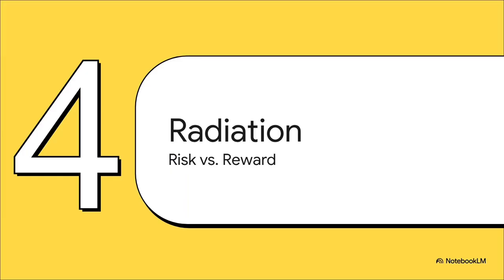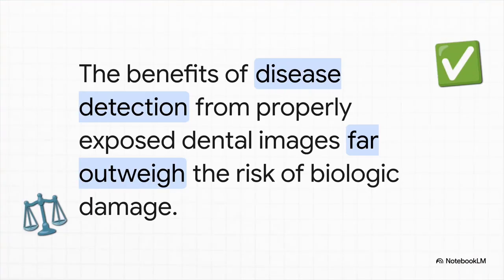All right, of course, we can't talk about X-rays without addressing the elephant in the room for a lot of people, radiation. So let's actually look at the real risk versus the incredible reward. So let's put this all in perspective, okay? The amount of radiation you get from a full set of modern digital dental X-rays is roughly the same as you'd get from a short 1 or 2 hour airplane flight.